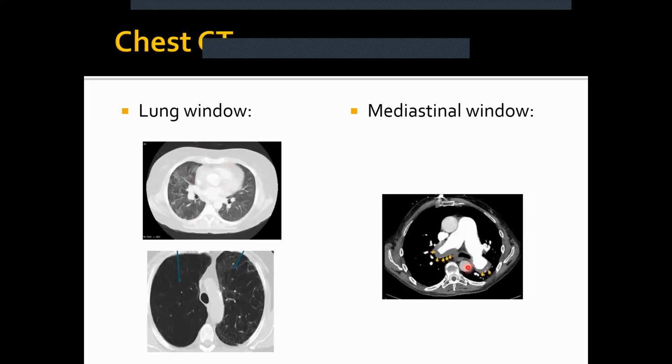Okay, and the same concept is with the mediastinal window. You want to see the structures in the mediastinum. You don't really care as much about bone, so that can all be bleached out, that can all be white. And you don't really care as much about the air, so that can all be completely blacked out. But when you want to see the grays, so you can tell the structures apart, you're going to put those pixels into the range of attenuation where the mediastinal tissue is.